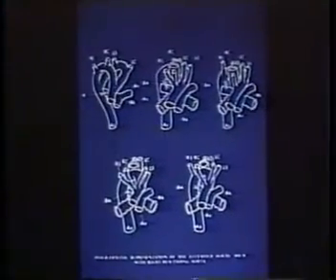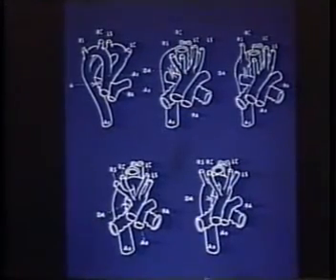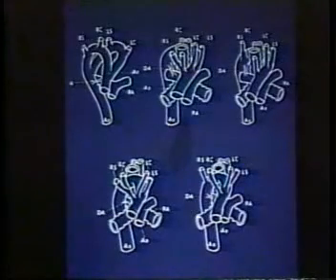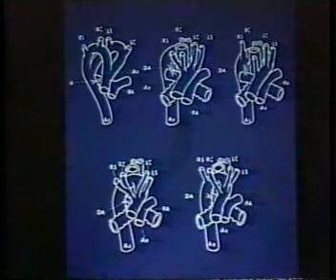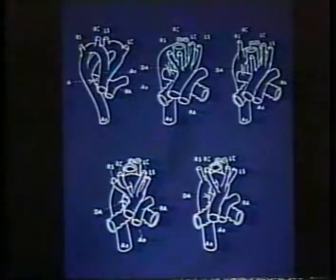I'd like to move to less common vascular rings, that of a right aortic arch with left descending aorta and left aortic arch with right descending aorta. I'd like to correct a misprint in the handouts that I submitted to Dr. Gooding. I believe it's on page 434 and 435 for those of you that brought that small tome with you. But in the left aortic arch with right descending aorta, the tracheal displacement is to the right, not the left as described. And similarly, the right aortic arch with left descending aorta, or the circumflex aorta, the tracheal displacement is to the left. As these are both similar, I'll only describe one.